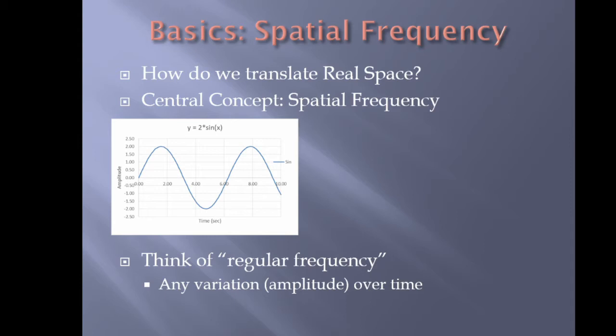Okay, think of a regular frequency. The word frequency, what does frequency mean? It means how often something happens over time. Well, as usually happens in any spoken language, we develop heuristics for ease of communication, and the word frequency is actually just a shortened form of the appropriate word, which is temporal frequency, because you can have any kind of frequency, including spatial frequency.